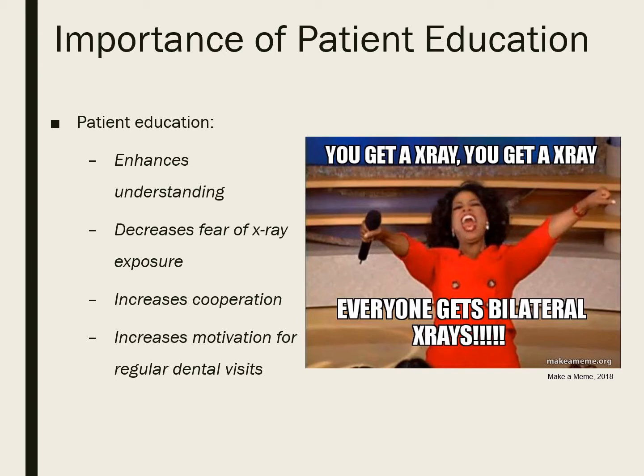It's going to increase patient cooperation, so the patients who understand the importance of dental X-rays are going to be more likely to have X-rays done. And then once they understand why we're using those X-rays too, it's also going to make them more cooperative when it comes to accepting their treatment and the treatment plan that the dentist has prescribed for them.